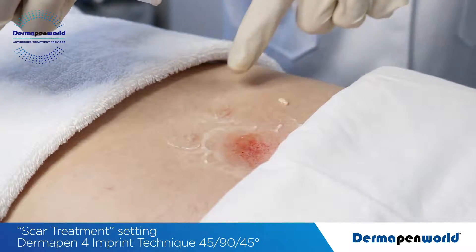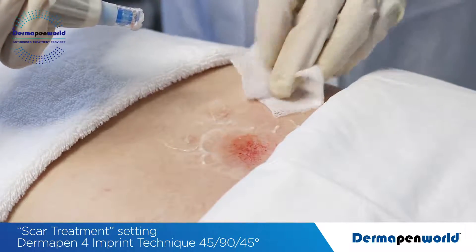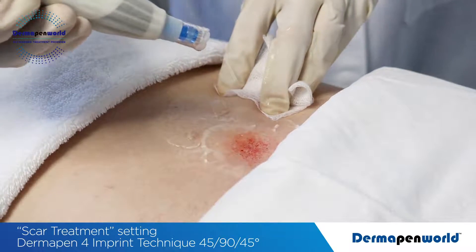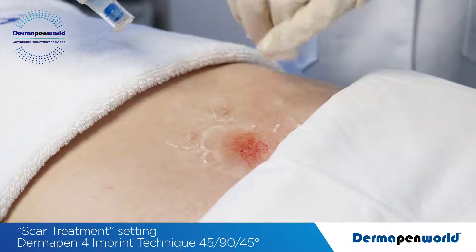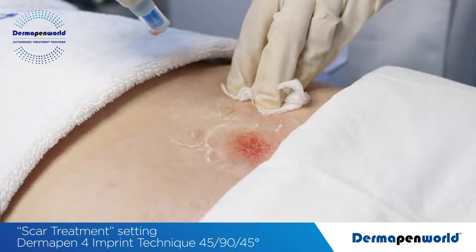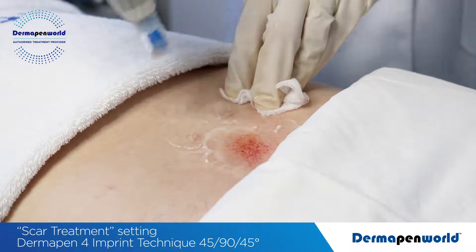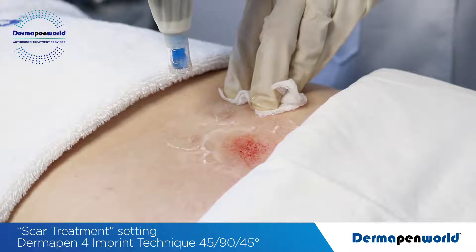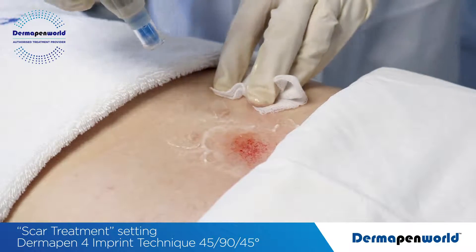Now working on our hypertrophic scars — because the Highlight Active Glide creates slip, use some gauze to support the surrounding skin and ensure that there is no risk of needle stick injury. We see this effect at 2mm for this top scar, so a 3mm setting will most probably be too deep for this patient. So at 2mm, we've reduced the speed down to speed 1, which is 66 revolutions per second.